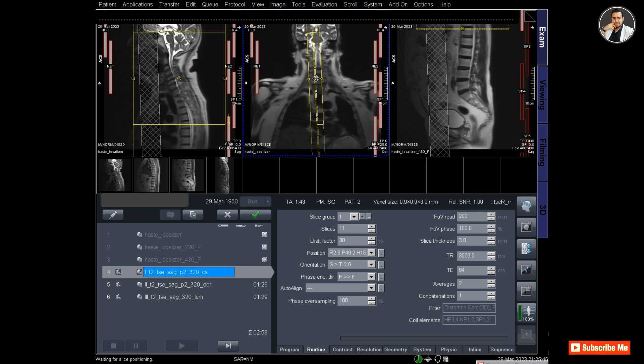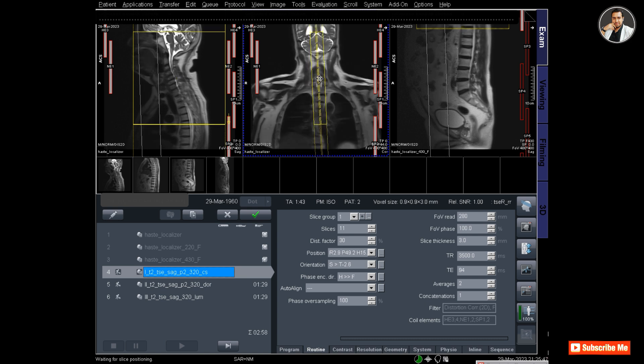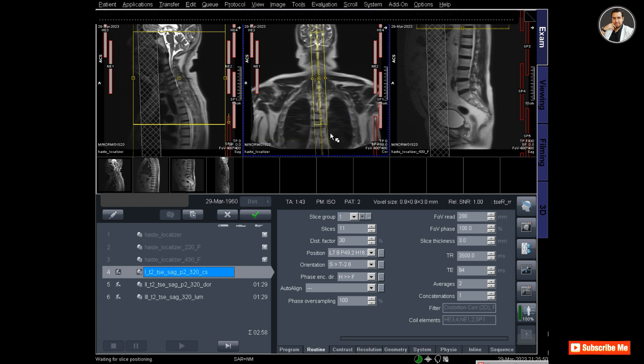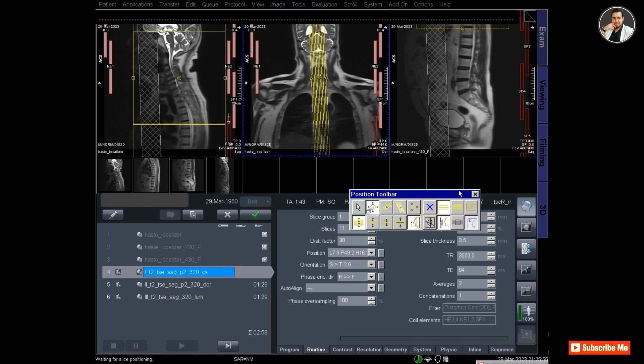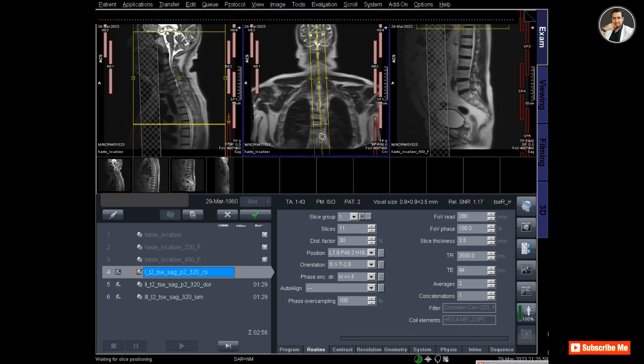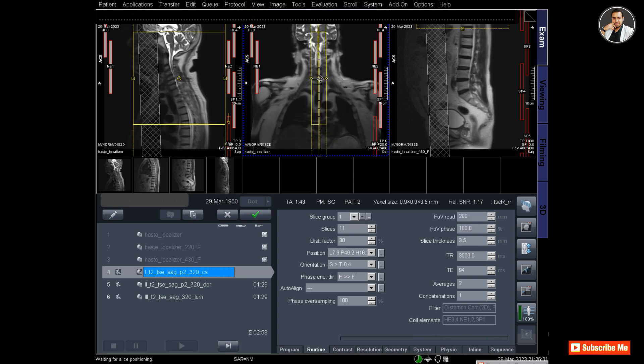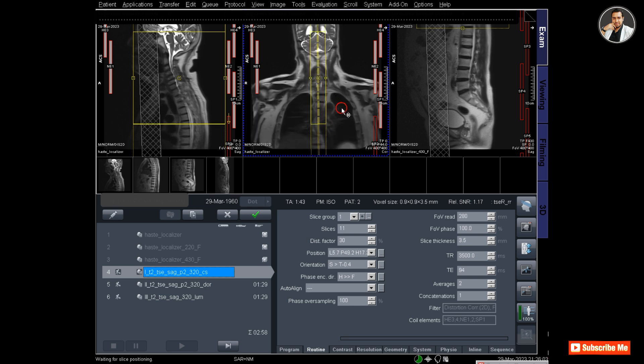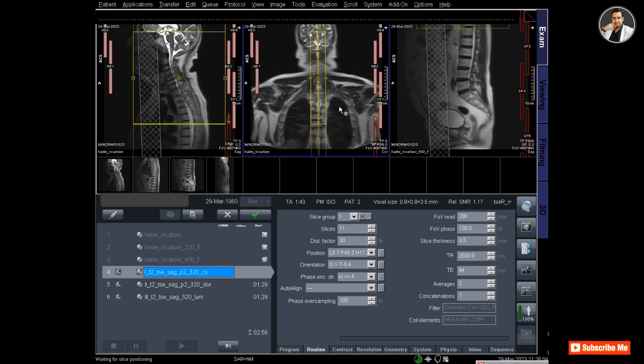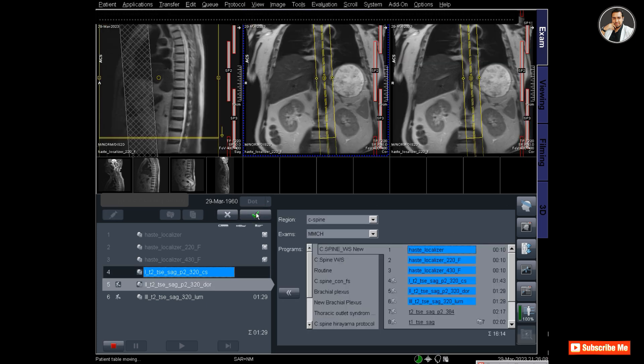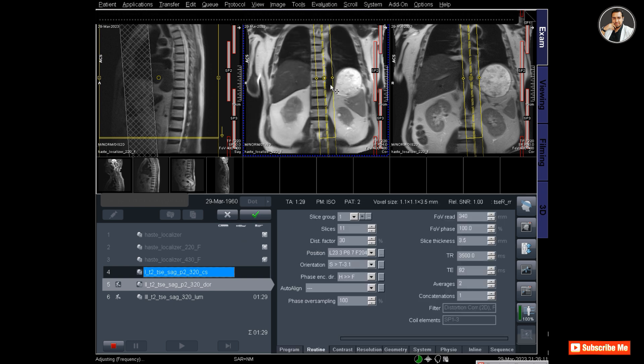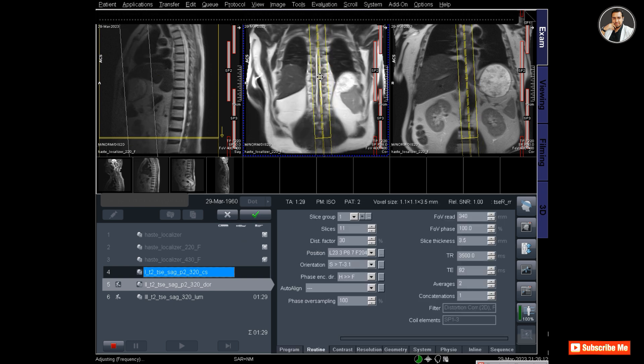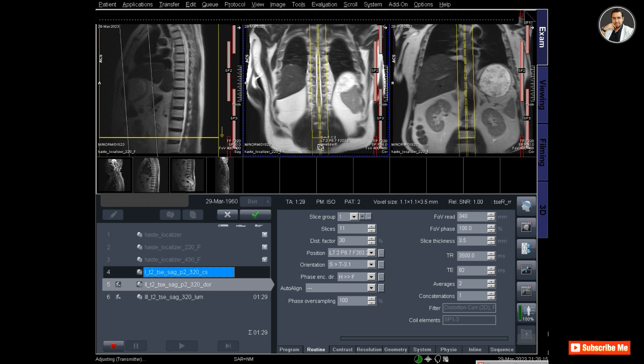Notice that the slice number is 11 and I'm increasing the slice thickness to 3.5. To compose the three-part Whole Spine - cervical, dorsal, and lumbar - make sure that all sequences have the same number of slices. For this, there are 11 slices for each protocol.